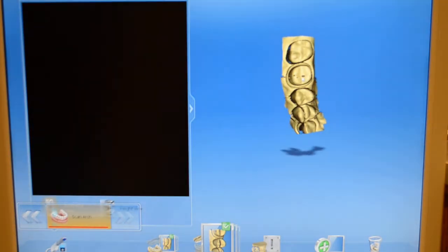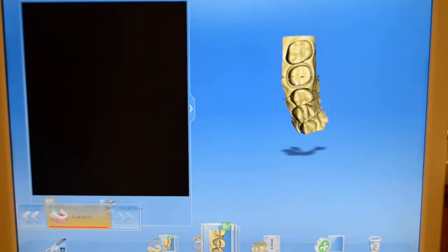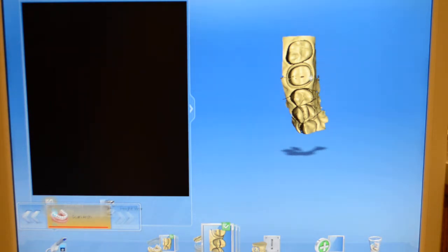This would be our working model for tooth number 14. We've got enough teeth. It's kind of like taking a quadrant impression. We've got 15 in view, 14, 13, 12, and a little bit of 11.